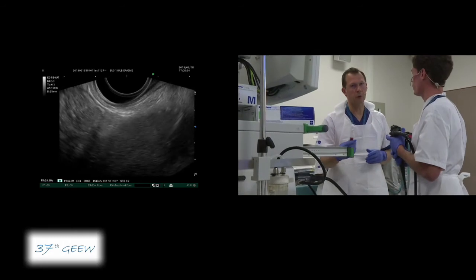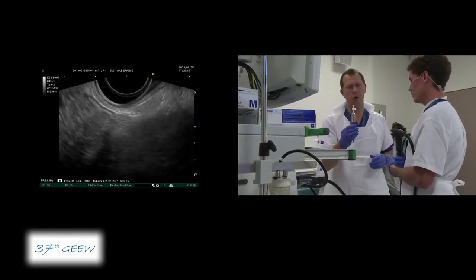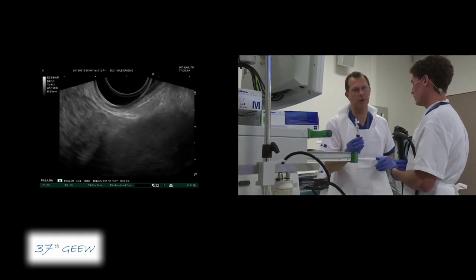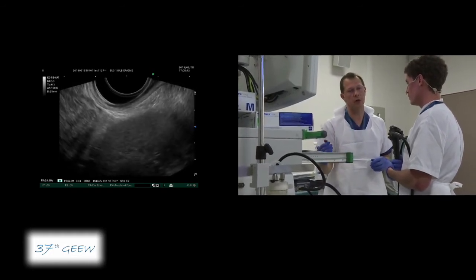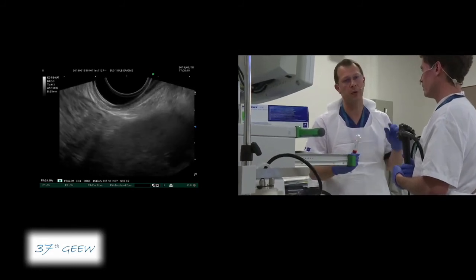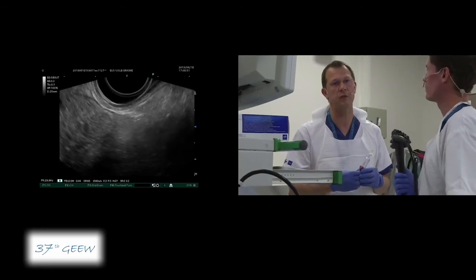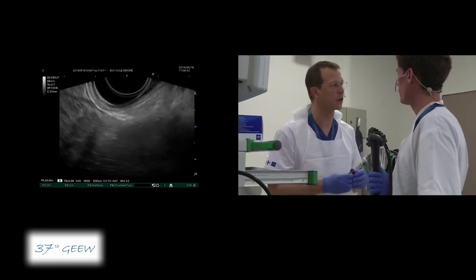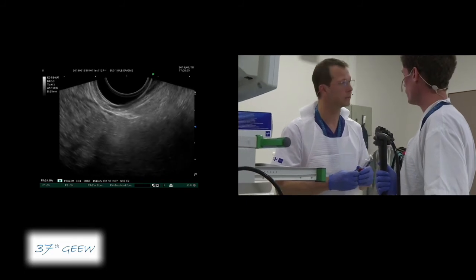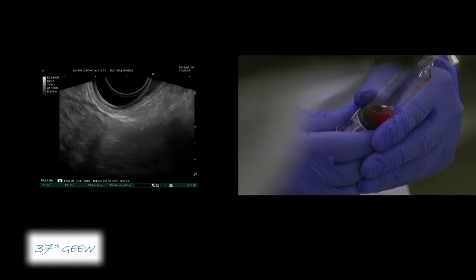We organize it so that, particularly for this kind of situation where we have a quite limited quantity of liquid, we send everything to the pathology department. They do the centrifugation. They keep the solid part and they send the rest for the chemistry analysis, for the lipase and the CEA. So that's very important, because you know exactly the process of this material.